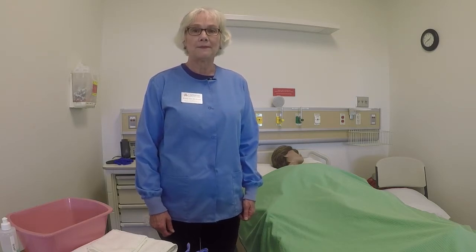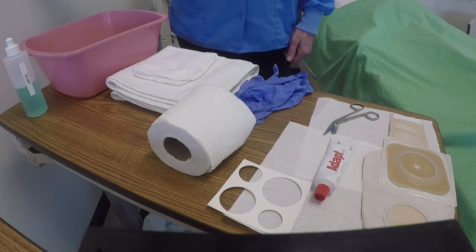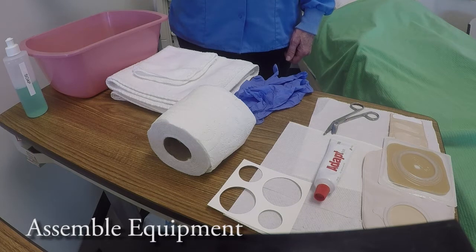I'm going to demonstrate the Nursing Assistant's skill for ostomy care for the established non-acute stoma ostomy. I call this the ABCs of replacing an ostomy bag. A is for assemble equipment.